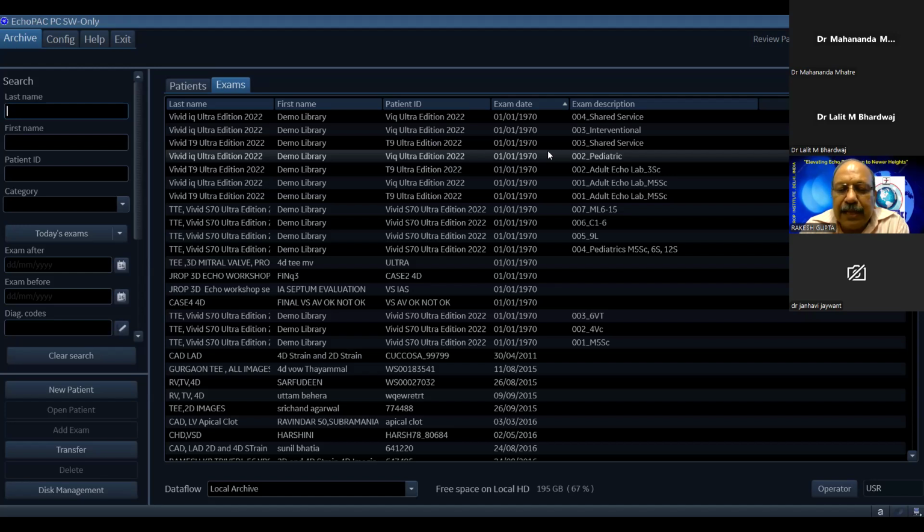That's 2. And third was color flow propagation velocity. Color flow propagation velocity is a very useful parameter in atrial fibrillation. What we do in atrial fibrillation, we look at E to E prime septal ratio more than 11, IVRT less than 65 milliseconds, and the E to Vp ratio, E wave divided by color flow propagation velocity, more than 1.4, which is suggestive of restrictive filling patterns. As such, color flow propagation velocity is important.